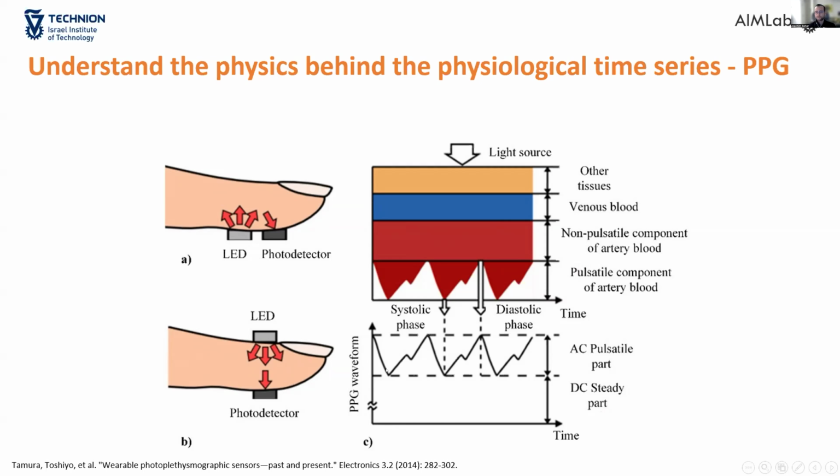And that's why the PPG waveform that we record looks something like this here. It is pulsatile, synchronous with the heartbeat, and has a shape that Márton will elaborate more on.